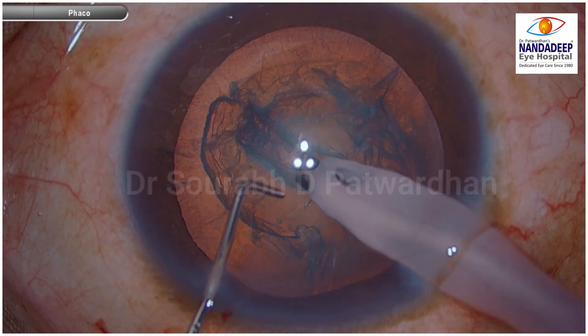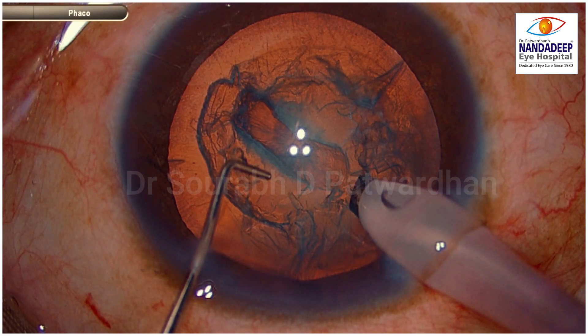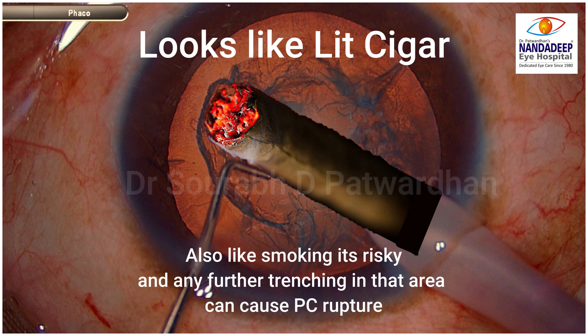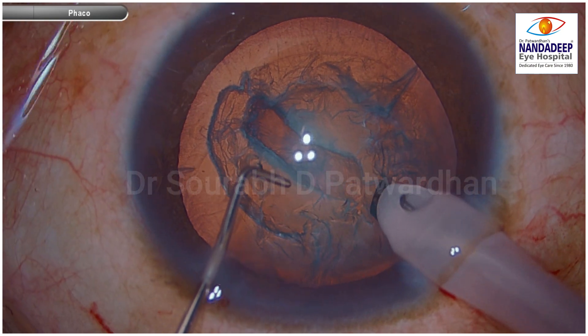When we are trenching, as I have mentioned in previous pattern recognition videos, we have to look at the color of the trench. What you see here is a softer grade of cataract with good red reflex, and you can see at the end of the trench the reflex is much brighter. It appears just like a lit cigar. And like smoking, it's risky — any further trenching in this area will lead to posterior capsule rupture.